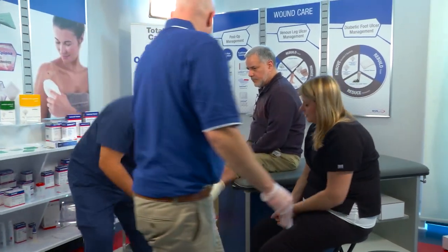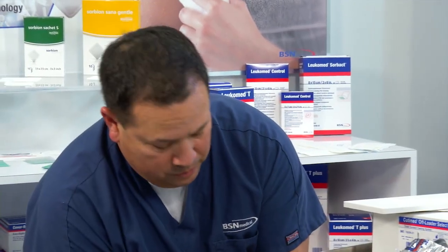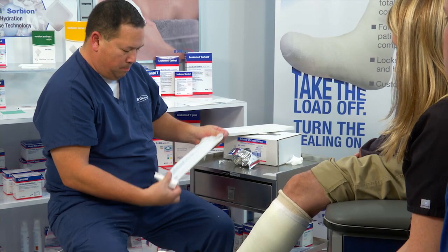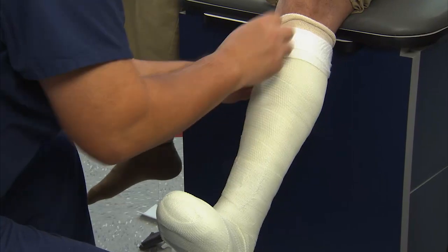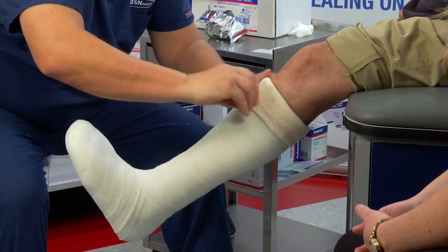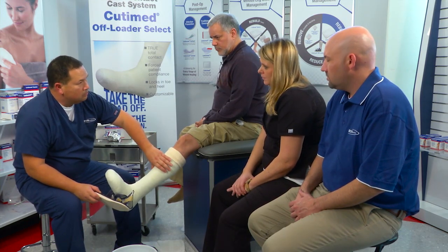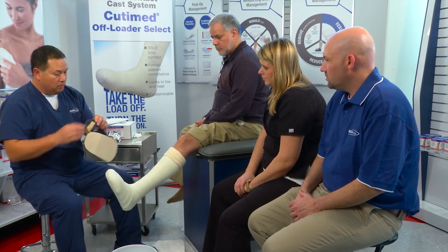This portion of the cast — you'll see that the cast is done, it's almost hard, almost solidified. I had this extra material, and I like to take a strip, fold it in half, wrap it right around the cuff of the cast, and pull this down, leaving it just like this. I've created a nice little cushion right here. The nice customization of the cast is it's one cast fits all — regardless if they're pes planus, pes cavus, or if they have Charcot, the same principles will apply.